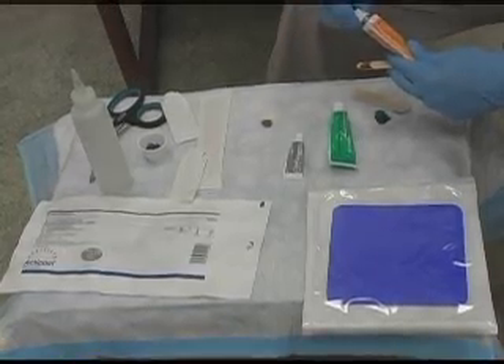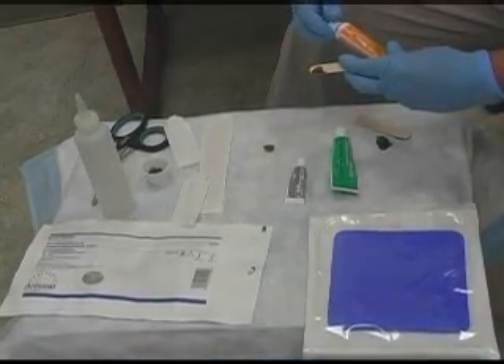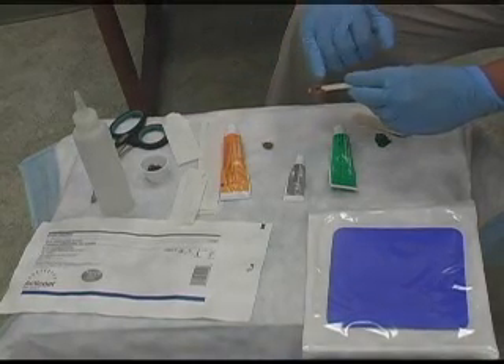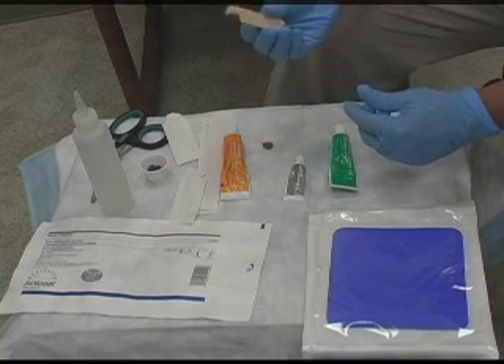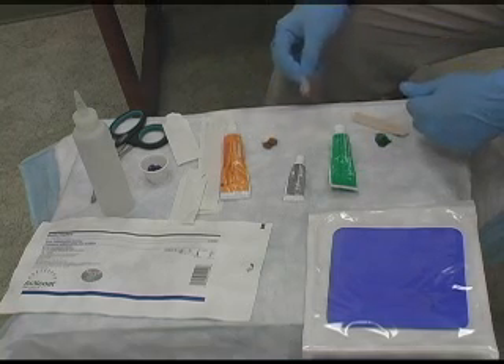When you change a dressing after you've used Iodazorb, you'll notice the color is nice and brown. When you change the dressing, if there's a lot of drainage in it, the iodine will release from it and into the wound, and this will get white and powdery. You can fill a cavernous wound with this using it in conjunction with calcium alginate, and it works really well.